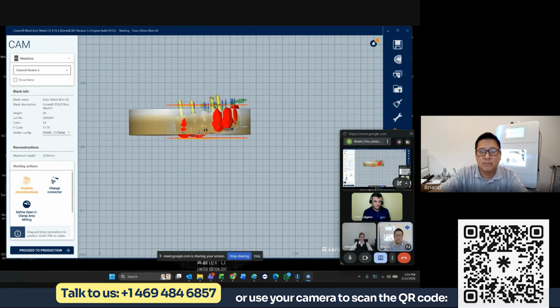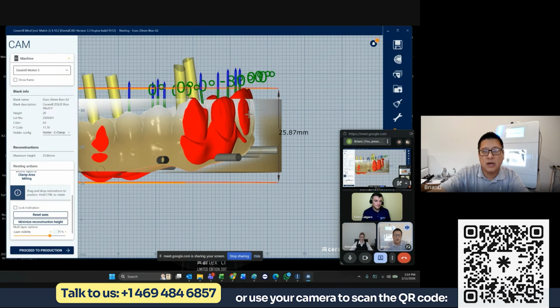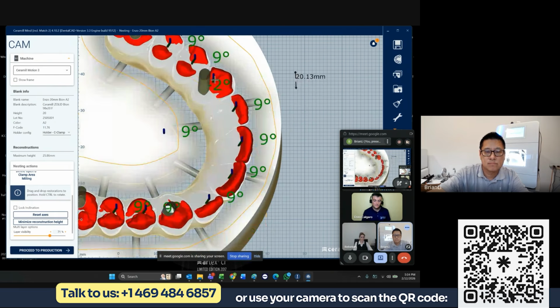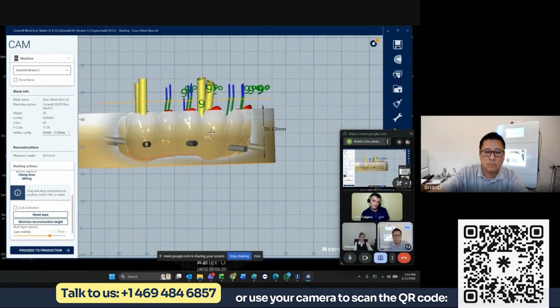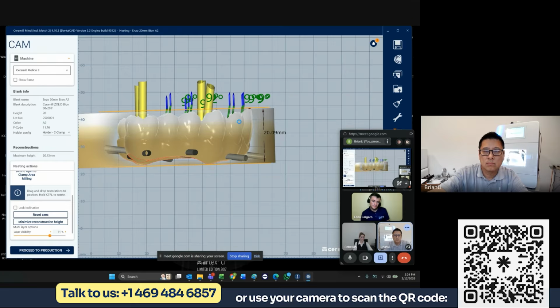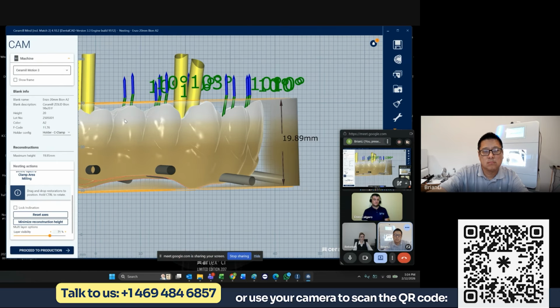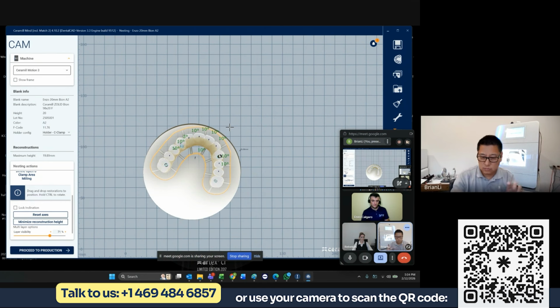So the case comes in, and maybe I picked too small a puck, but let's see. I'm going to unlock and rotate this.